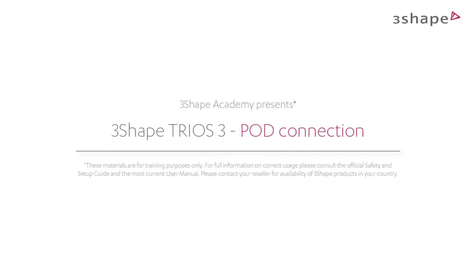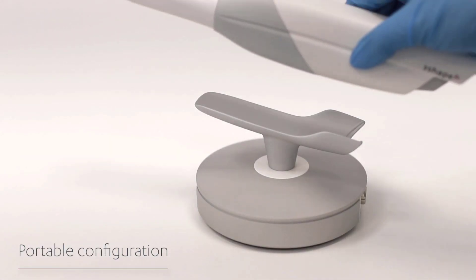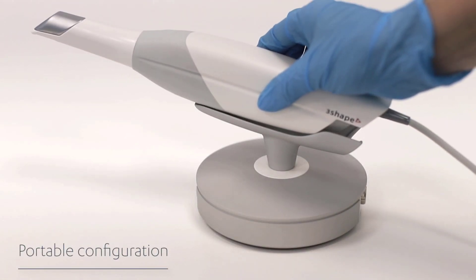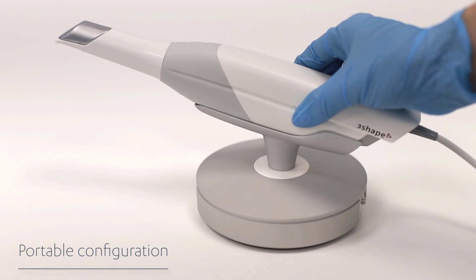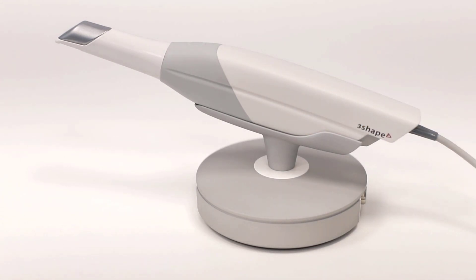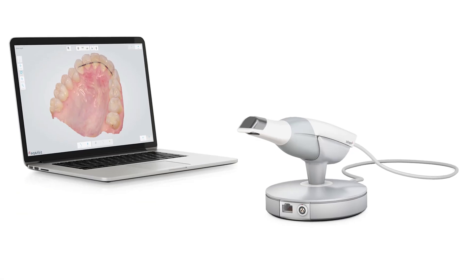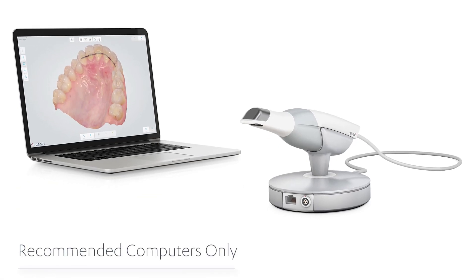In this video, you'll learn how to connect a Trios pod. The Trios pod is 3Shape's mobile and flexible solution for dentists working in multiple locations or for clinics with limited space. 3Shape will only support Trios used on approved PCs.